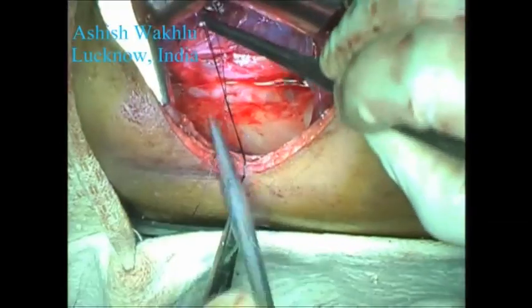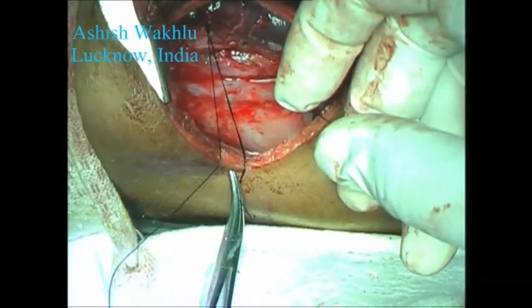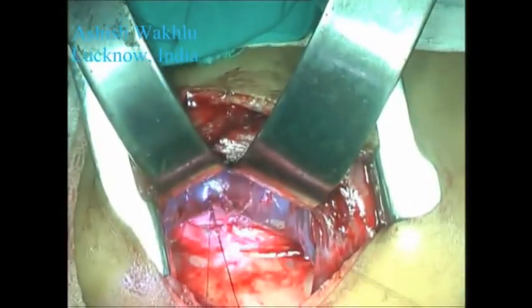We are now applying stay sutures in the exposed bronchial bifurcation of the right lung to keep it in vision till the stump of the right main bronchus on the tracheal side is exposed.